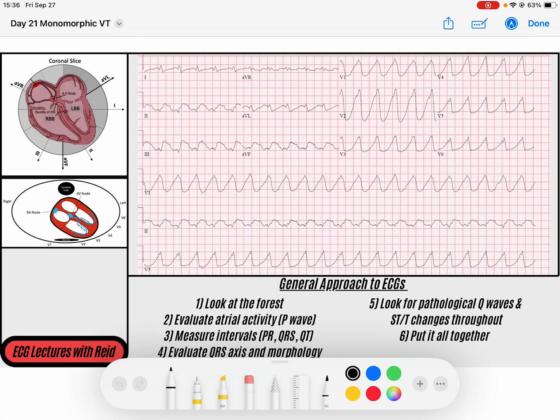Hey everybody, welcome back. We are in day 21 of our 30-day EKG challenge and we're diving into monomorphic VTAC. We're going to be going over two monomorphic VTAC EKGs over the next two days — one today and one tomorrow. Not every monomorphic VTAC is created equal, so getting a couple of reps in is most beneficial because there are plenty of features that help diagnose VTAC on EKG that won't all appear on one EKG. I tried to pick two from my EKG vault that would best display them when combined together.